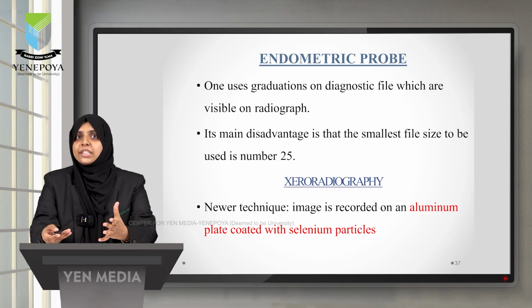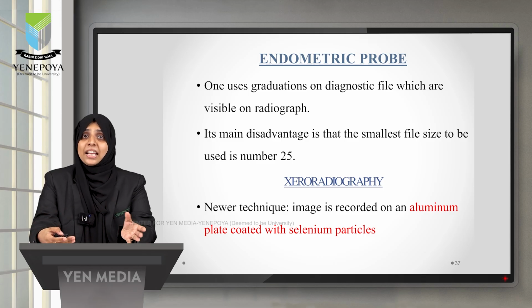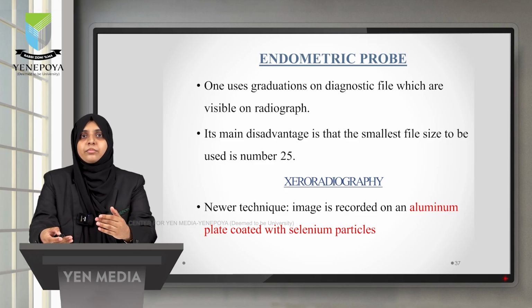The advantage of this technique was that it was found to have a good edge enhancing property, which gave better details. But the disadvantage was that, since it has an electric charge, in the presence of saliva there could be a flow of current which can cause discomfort to the patient.